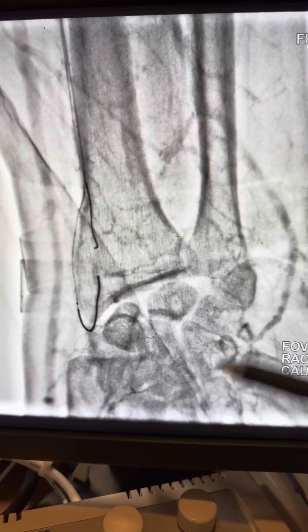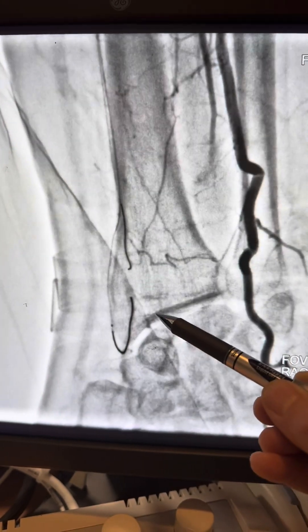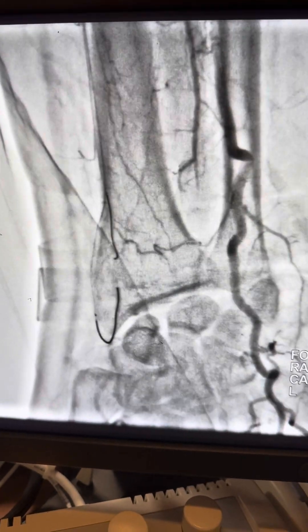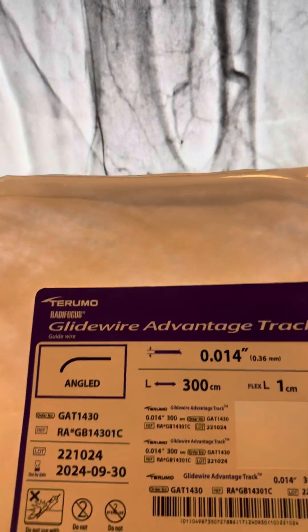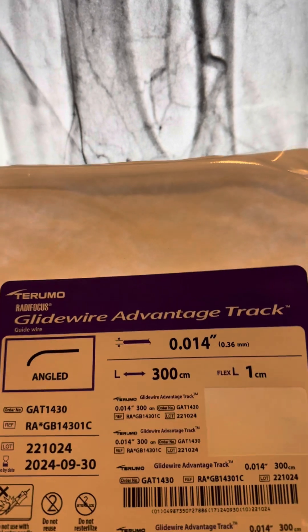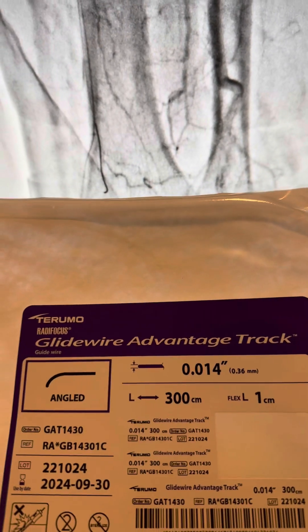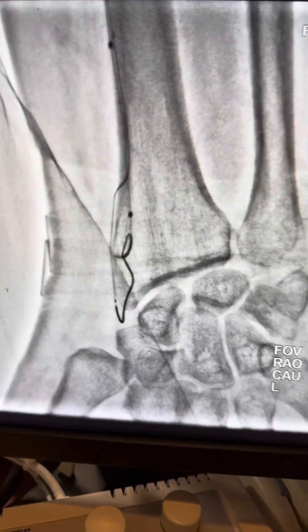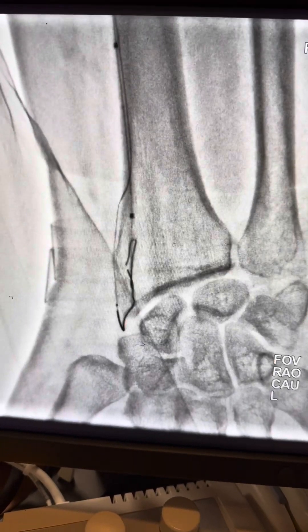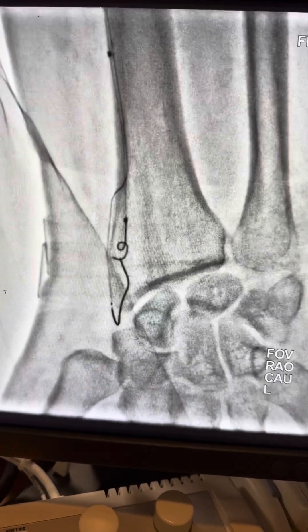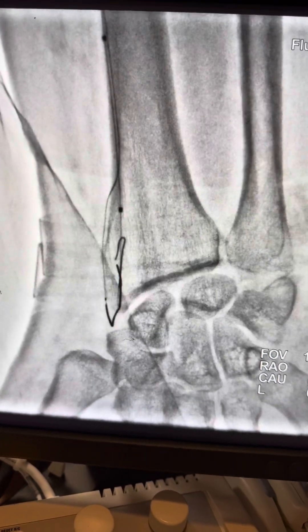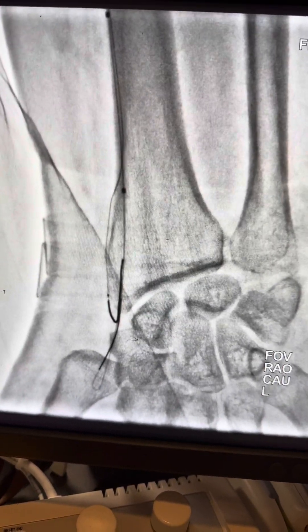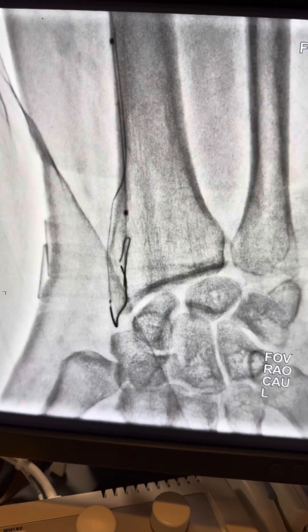I kept the run-through in the small branch going backward, just to guide the other wire. I used a different wire — a Terumo glide wire, 0.014, 300 centimeter, with an angled tip. I supported that new wire with the balloon distally, then created a kind of shoulder effect and pushed the wire against the CTO cap to enter the true lumen.